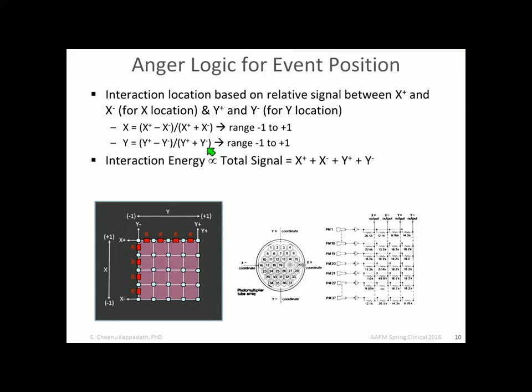positioning. And then obviously the total signal that you measure is proportional to energy. That is one of the hallmarks of a scintillator, right? The light output is proportional to the incident energy.